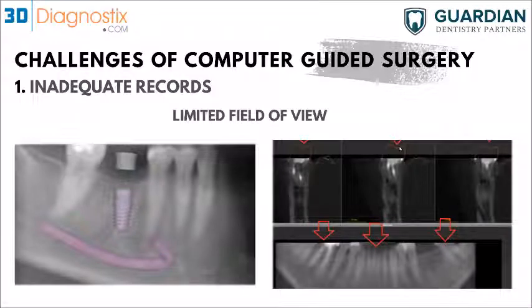So here, this is a screenshot of an example, of course, showing that the coronal part of the tooth or the crown is not in the scan, so it wasn't recorded, and then you have this huge gap or space, and you cannot match the outline of the dentition in this intraoral scan with that scan. So this is actually one of the challenges we face when we receive those records.